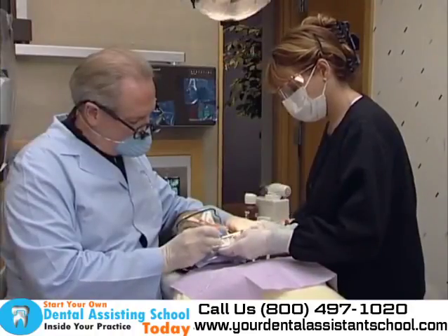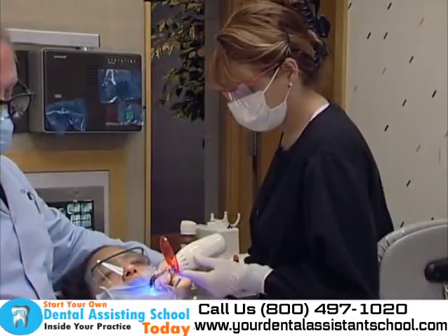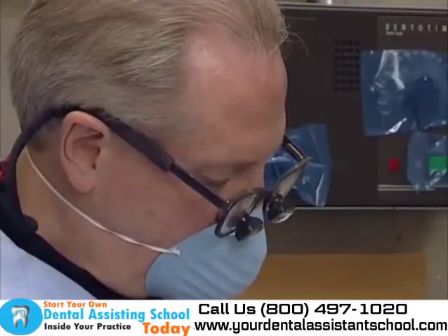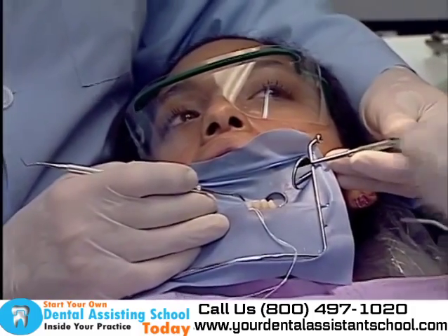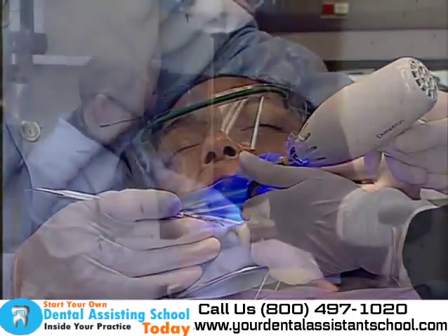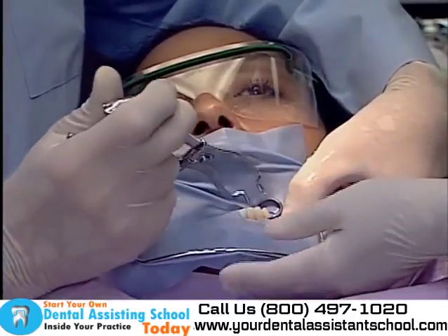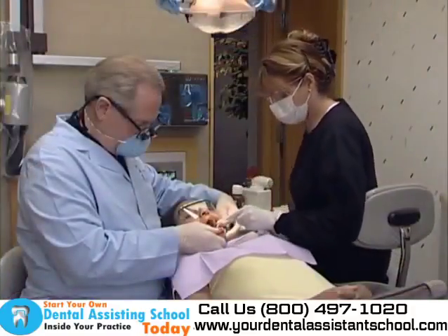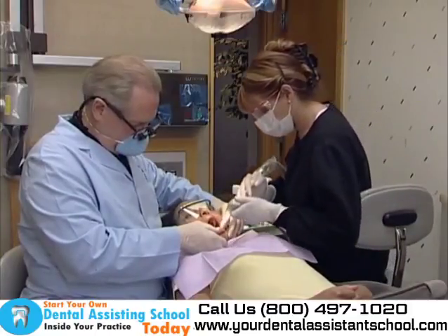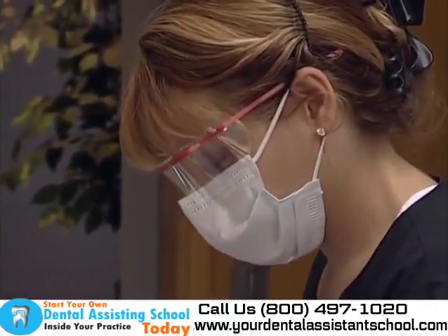The dentist then inserts the composite resin with a composite filling instrument. A curing light may be used to aid in the hardening process between layers. The dental assistant cures the material, and the dentist repeats the process of filling the tooth. Once the composite is cured, the rubber dam is to be removed. The dental assistant is responsible for holding the patient's cheek away from the scissors, passing and retrieving instruments when necessary, and using the air and water syringe and HVE to rinse and evacuate the patient's mouth. Once complete, the occlusion is checked and the final finishing takes place.